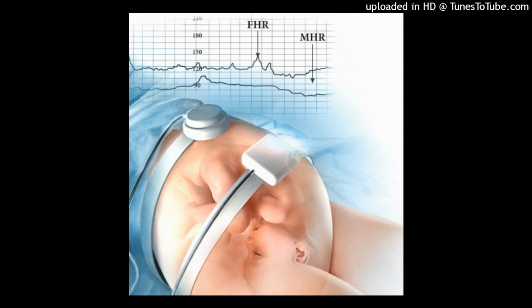births. While IA and palpation continue to be a reasonable approach to assessing fetal status in a low-risk patient, EFM technology gained popularity. Compared with earlier generations of fetal monitoring systems, today's EFM systems are more innovative than previous systems, allowing for more efficient bedside care.